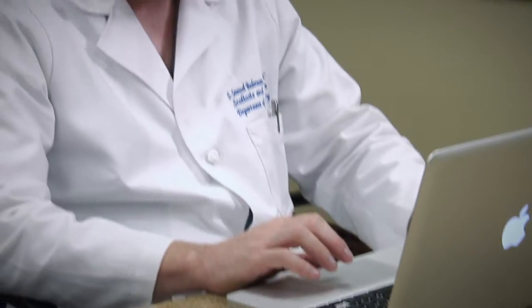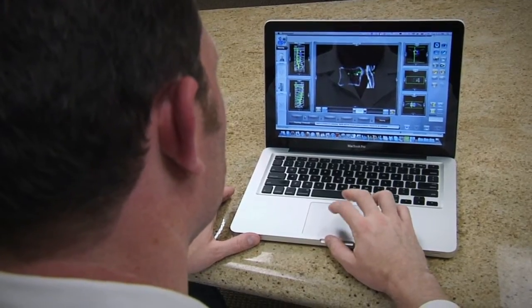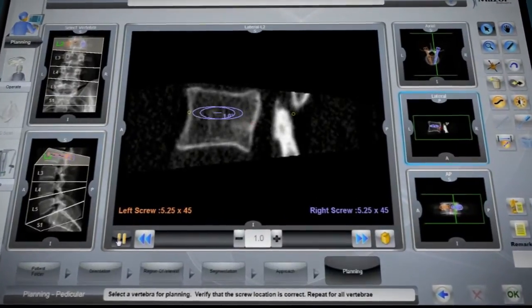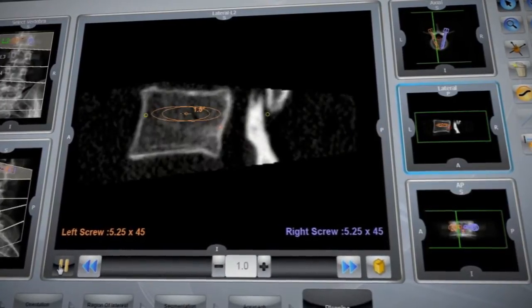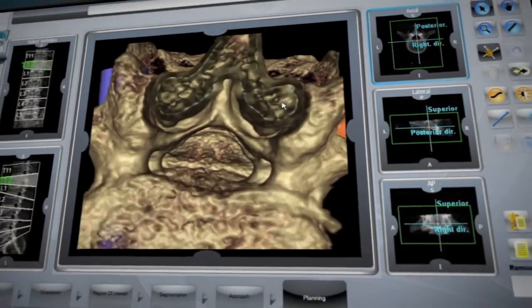All preoperative planning can be performed on your personal computer with Renaissance software installed. To enhance procedure safety, you can review the preoperative surgical blueprint in a virtual video mode on Renaissance's planning software. This displays implants slice by slice on the CT in all three surgical planes, as well as a full 3D review of the surgical blueprint.